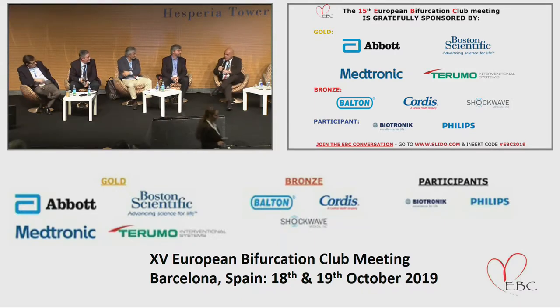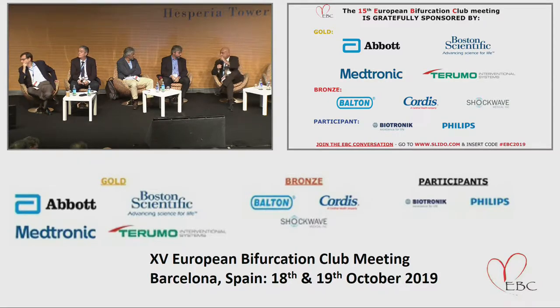My question is very quick. It's very interesting, really the first time I see that you do angioplasty and with one device you have morphology and physiology. This is the thing that I think every one of us wants to have. My question is about the gray zone of OCT. Probably you have a gray zone quite dangerous, according to me. I mean, something like 75, 80 means that you can have stenosis from 40 to 70%. Generally, these methods, because they are not really physiologic, have a very bad gray zone.